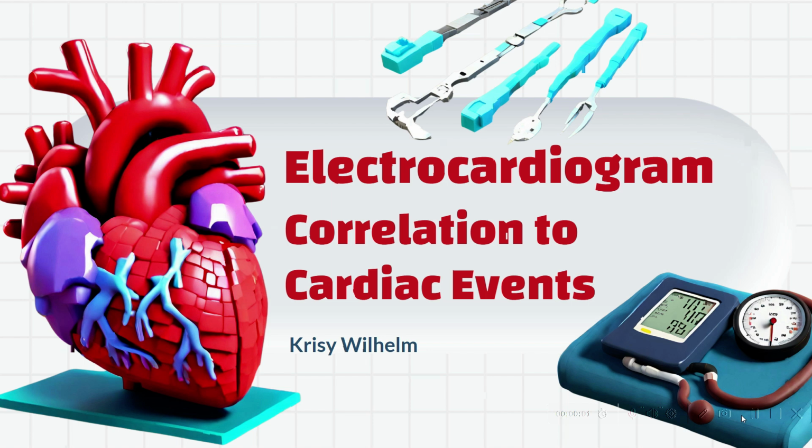An electrocardiogram, also known as an ECG or an EKG, is a non-invasive diagnostic tool used to measure and record the electrical activity of the heart over a period of time. It provides a graphical representation of the heart's rhythm, rate, and electrical conduction patterns by detecting electrical impulses generated during each heartbeat.